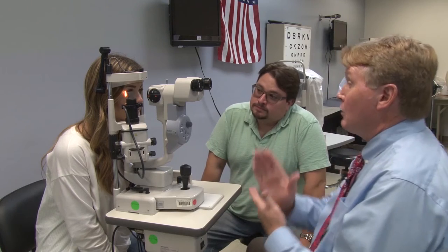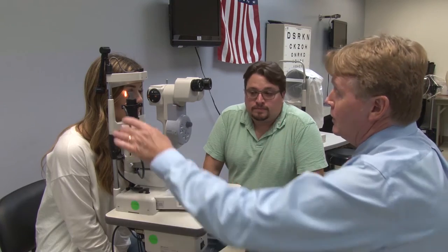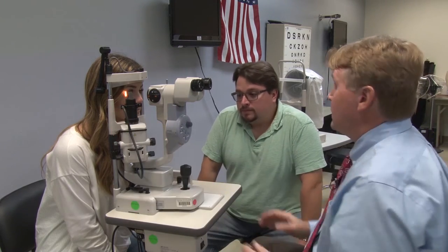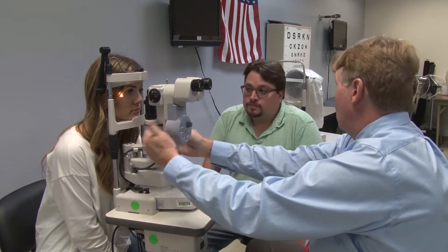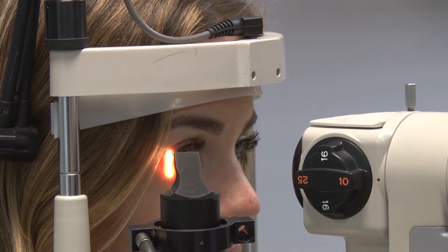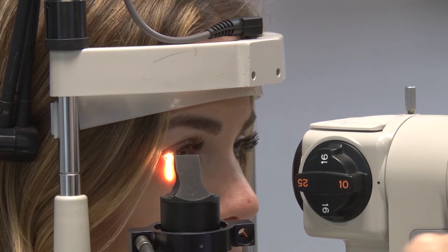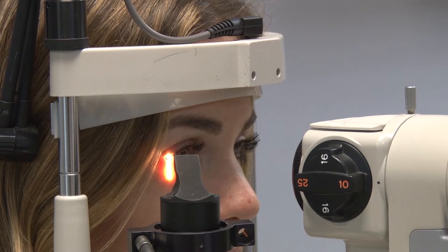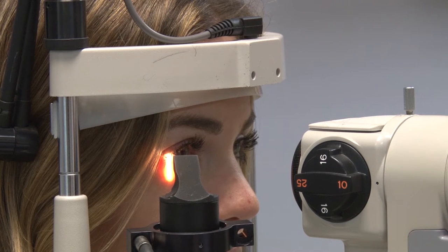As we look at her eye, we're going to divide it right down the middle. Any time we're looking at something from the middle of her eye toward her ear, the light source is toward her ear. Any time we're looking at anything from the middle of her eye toward her nose, we're going to be moving the light source over toward her nose. We want the light beam high enough so that it's over the lid margin, across the lashes, across the lacrimal lake, and just a little bit up onto the bulbar conjunctiva.